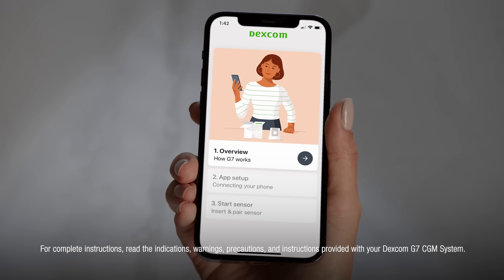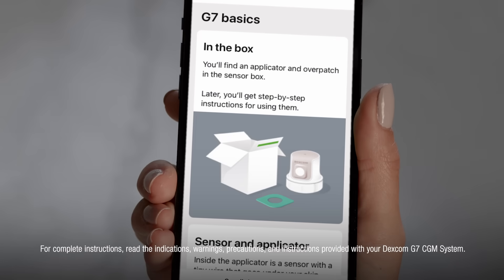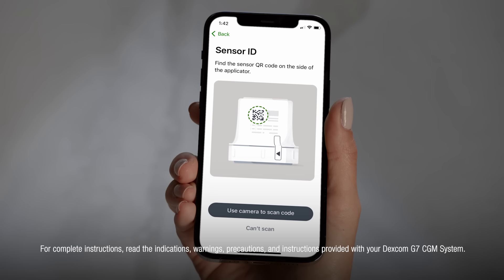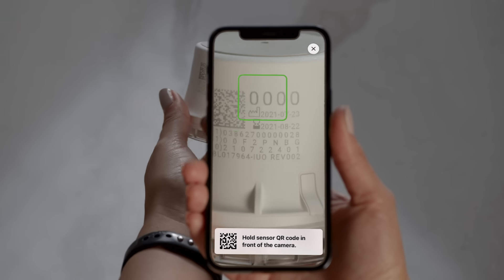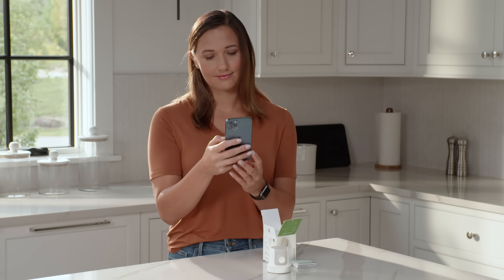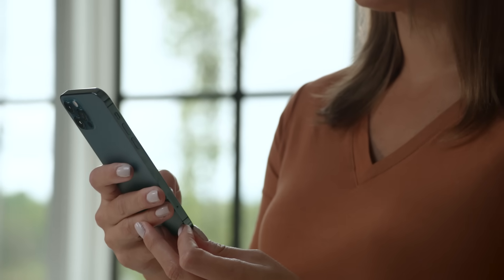First, the overview section will provide you with some basics about your system. Then you will enter your sensor ID — grab your sensor and press 'Use Camera' to scan the code. Next, you will be provided some educational videos and screens so you can learn about your Dexcom G7.